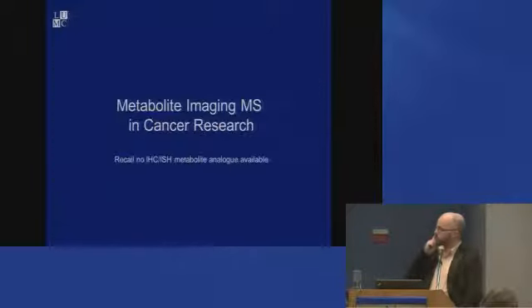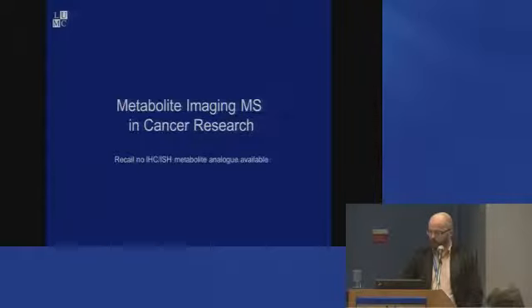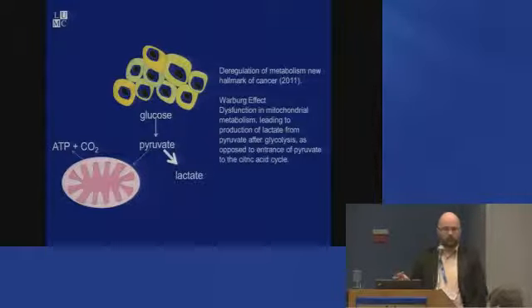So we've also started applying metabolite imaging in cancer research. This is the main topic of this talk. Recall there is no immunohistochemical or in situ hybridization analog for metabolites. So this is where we can add real added value.